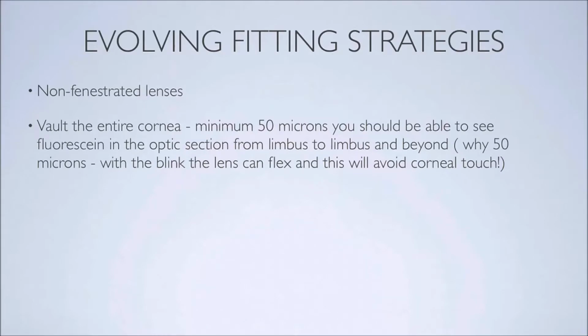the lens can touch the cornea. I want to avoid corneal touch. So 50 microns is my minimal area of clearance under the lens. I avoid bubbles on insertion.